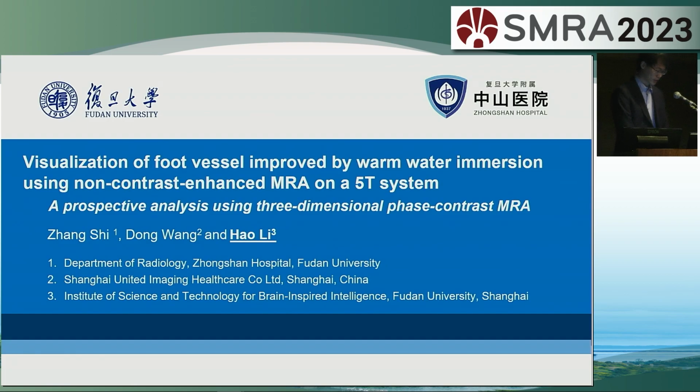Thank you for the introduction. Good morning. I'm Hao Li from Fudan University. In this work, we perform non-contrast enhanced MRA on feet using a 5T system, and we improve the visualization by warm water immersion.